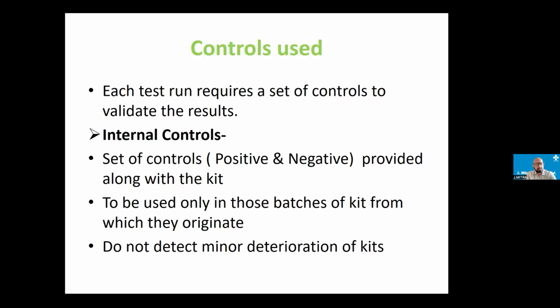When the CLIA value is more than 100, we're actually getting true positive values. In our last study on 65,000 donors, we found 163 HIV positive cases, that is CLIA positive. But when we repeated those positive samples with NAT and rapid testing, it came out that out of 163, only 51 were NAT positive, and 50 were rapid positive.